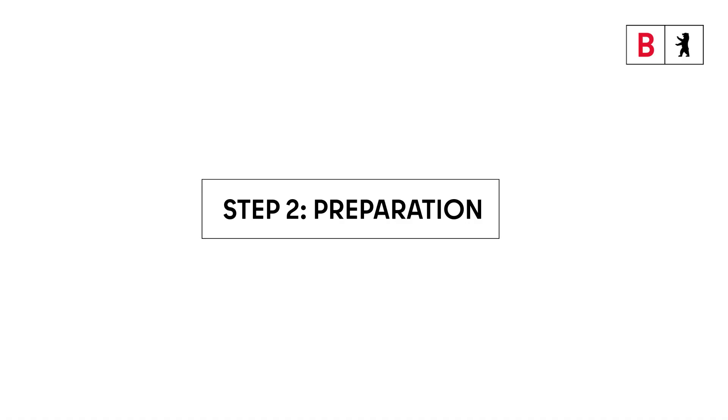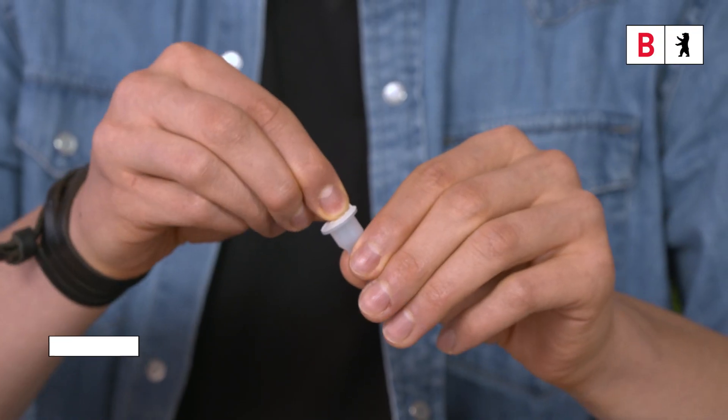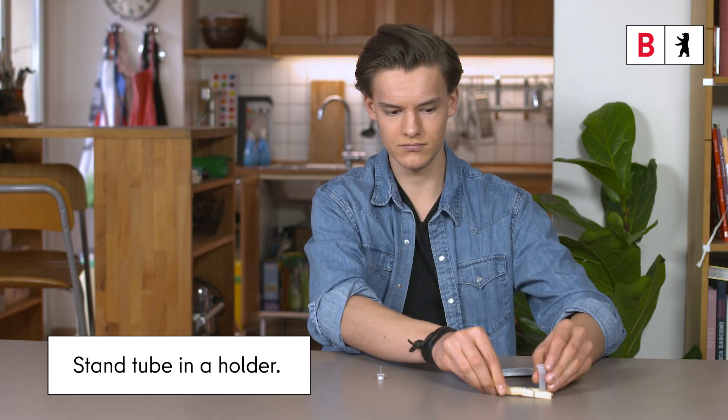Step 2. Preparation. Remove the foil from the tube and place the tube in a holder. The buffer solution is in the tube.